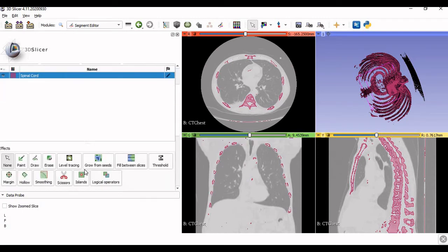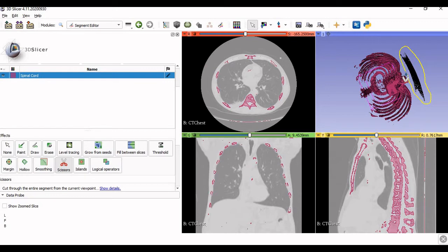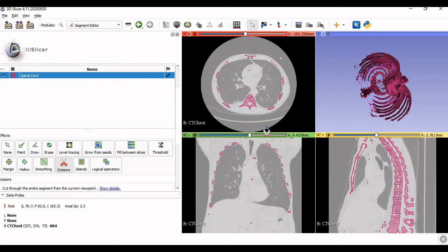The best tool I find suitable for editing is the Scissor. Once you click on Scissor, you can go to any view window and cut unwanted geometry. For a part I know is extra, I draw a boundary by clicking the left mouse button and close the boundary — whatever is enclosed in that boundary will be removed from the selected part. For example, I don't want the ribs, so I draw a boundary around them to remove them.